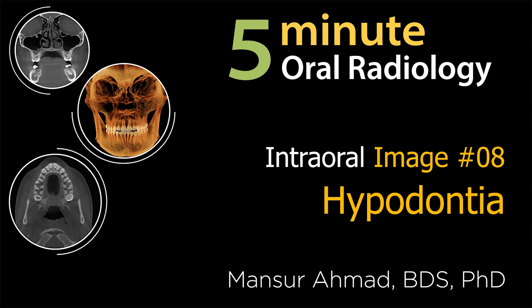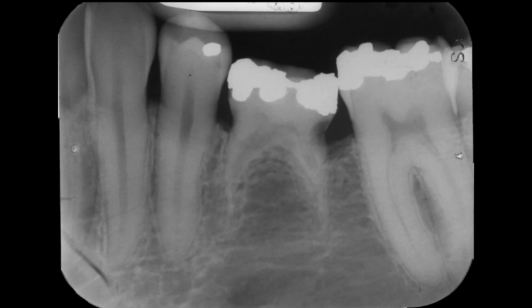In the fall semester of D2 year, we had earlier learned about hypodontia. On this mandibular left premolar radiograph, we see the first molar, deciduous second molar, and first premolar. The second premolar is missing.